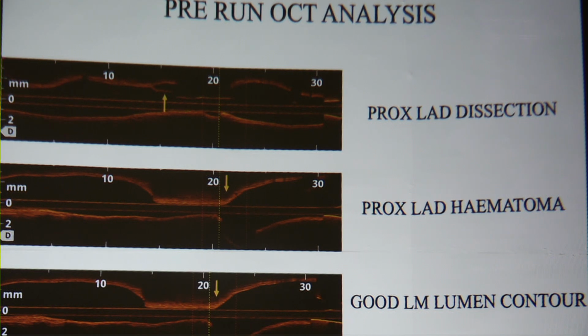Other than having a progression to the aorta, there is a risk of an occlusion of the left circumflex as well. And this is the left main. Either you have to observe in the cath lab itself, it's not going to give you the time to take the patient back the next day. In case there is occlusion of the left main, it's going to be a catastrophe.